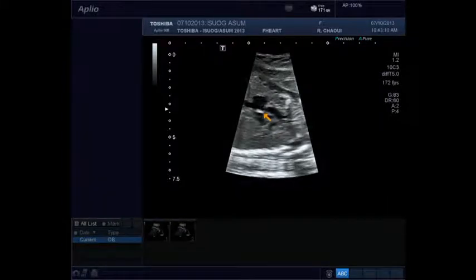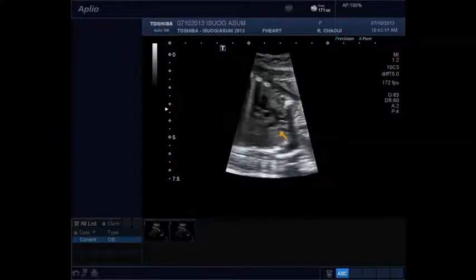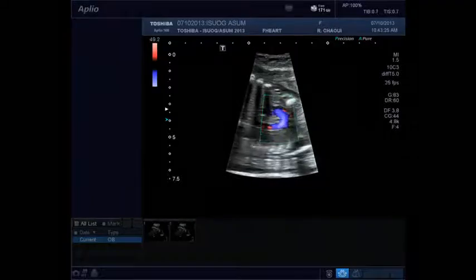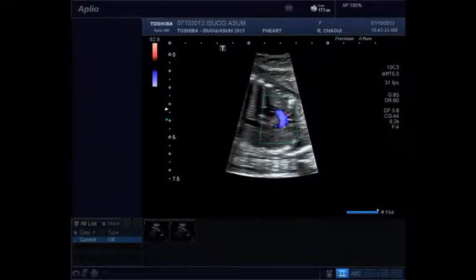You see here, this is the ascending aorta. Under the arc, there is the right pulmonary artery branch. You see 1, 2, and 3 vessels. This is the arc. Maybe you can point where are the common areas of coarctation. This is the region of the isthmus, exactly here, after the 3 vessels rise from the aorta. This is where we expect to see coarctation.